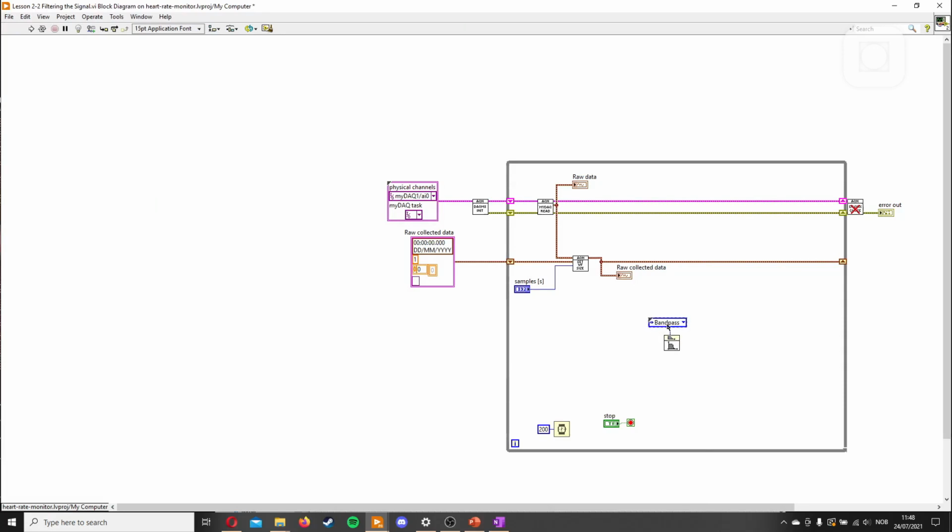We choose a bandpass filter as we want to filter out lower and higher frequencies than we don't want to use, because your heart rate will not go under 40 beats per minute and probably not go above 200. We'll set the limits later, but the point is we want to set a lower limit and a higher limit, which is our band, and that's why we choose a bandpass filter.